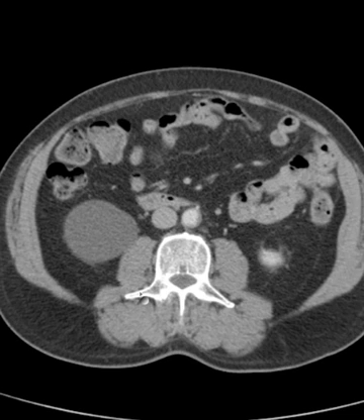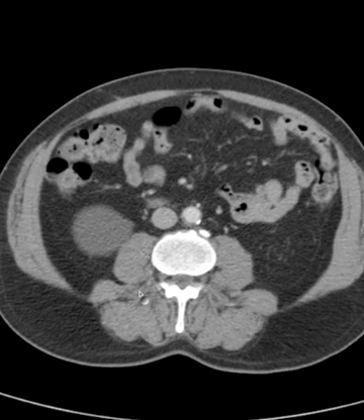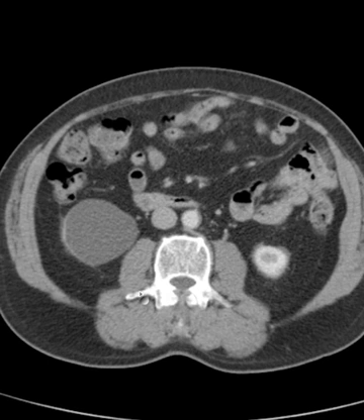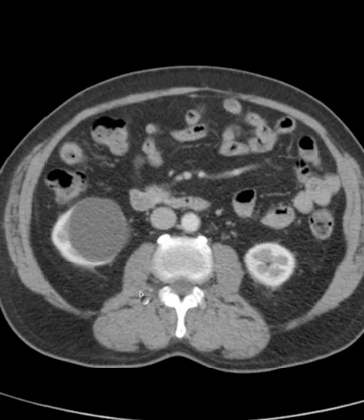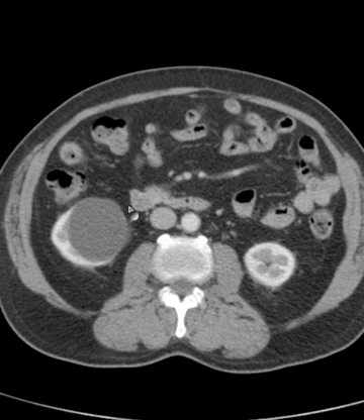Go through the kidneys, and yes, there's one abnormality. And what is that abnormality? It is a renal cyst.